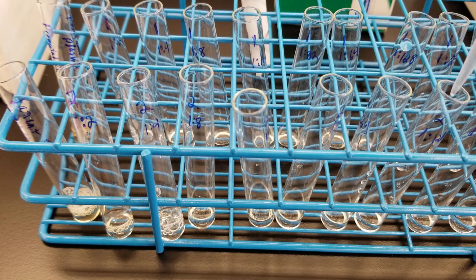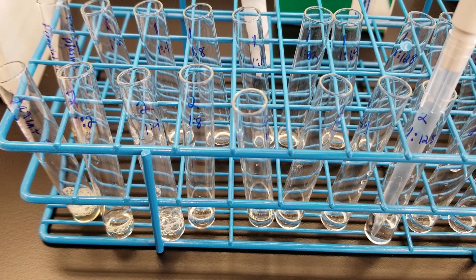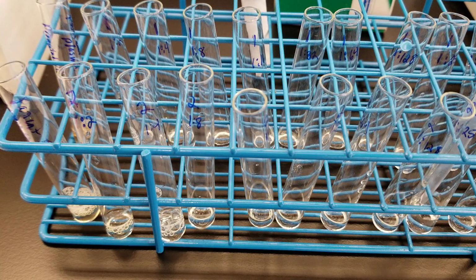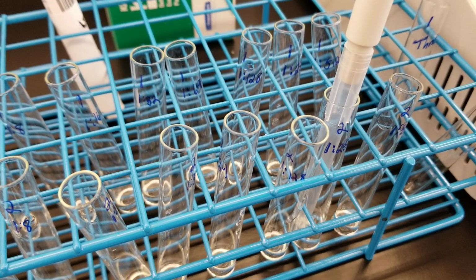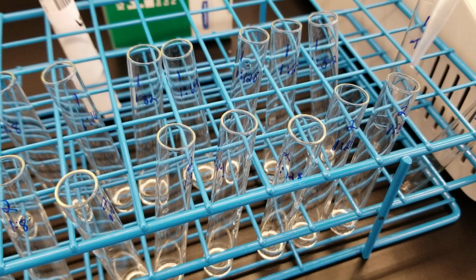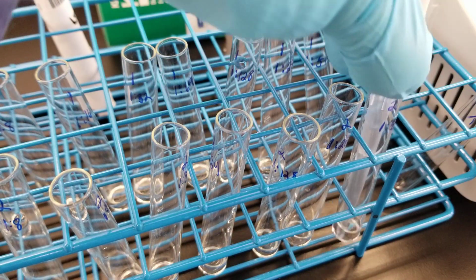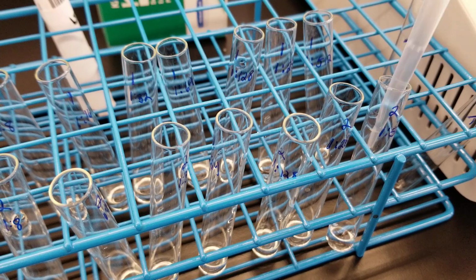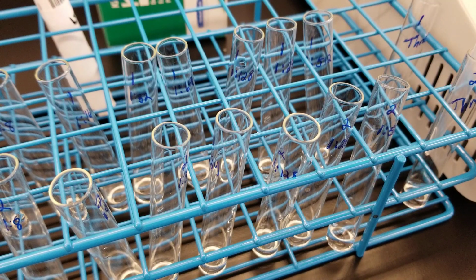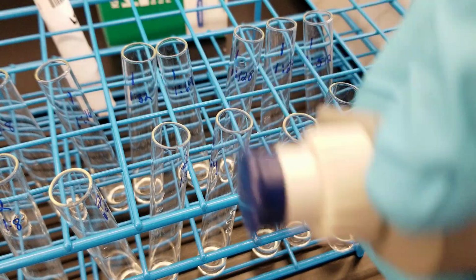So I will only do this first line in front of you so that we won't waste a whole lot of video time. So I did my serial dilution up to 512, okay? And I'm going to put the end in the throwaway tube, all right? This, and I'm gonna get rid of this tip, right? I ejected it using the ejector button.